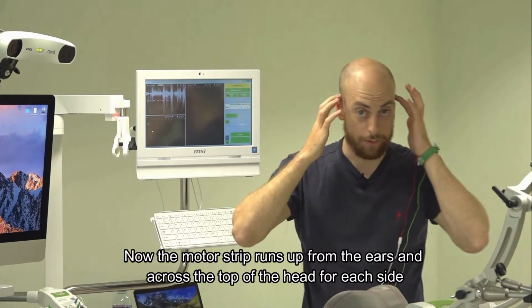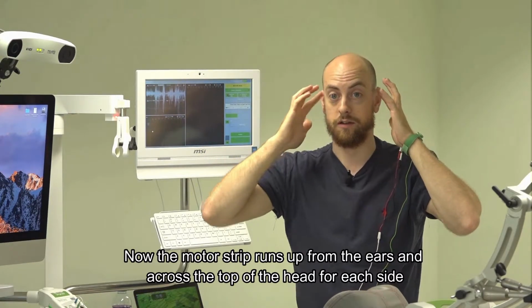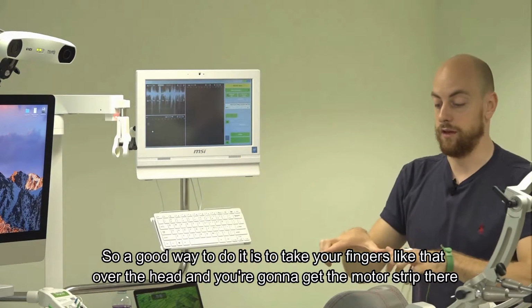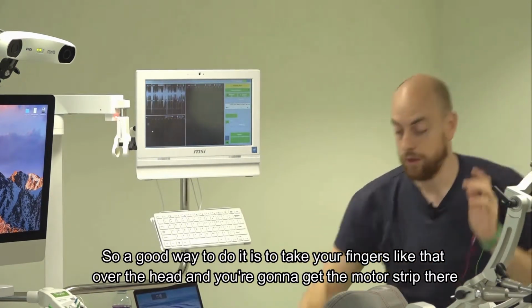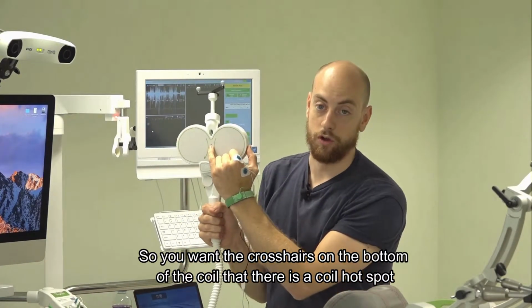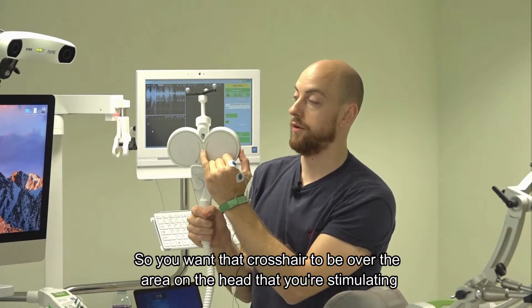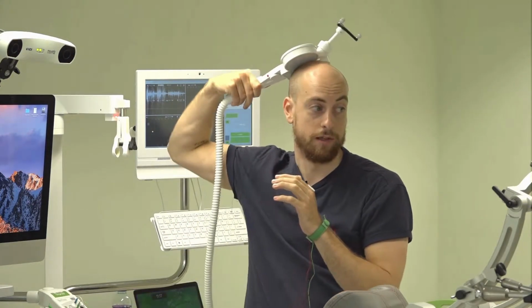Now the motor strip runs up from the ears and across the top of the head for each side. So a good way to do it is to take your fingers like that over the head, and you're going to get the motor strip there. So you want the crosshairs on the bottom of the coil. That there is the coil hotspot. So you want that crosshair to be over the area on the head that you're stimulating.